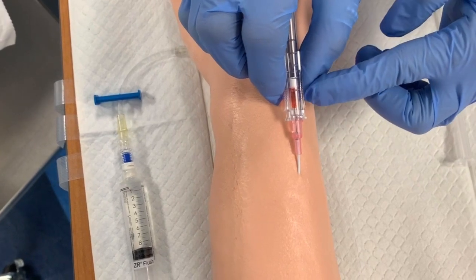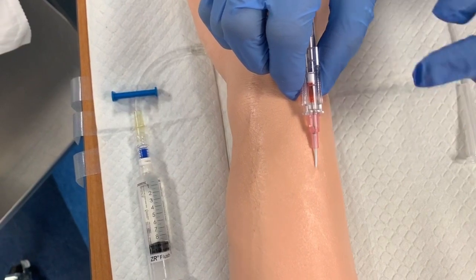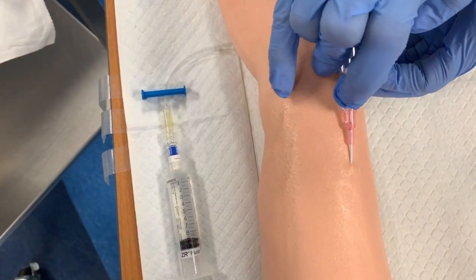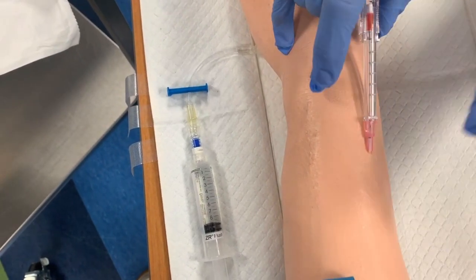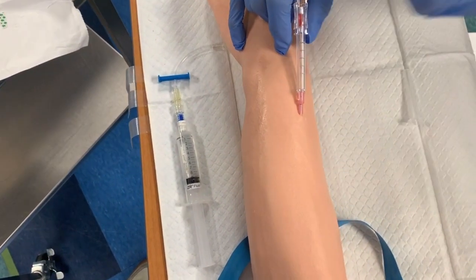Once you get blood return, you'll see it back in your catheter here. And once I get that initial blood return, I advance my catheter just a squitch more, a couple millimeters, and then we can activate our safety device. So we're pushing the catheter in and pulling back the needle. Did you hear that click? That's our needle disengaging. Now we're going to remove our tourniquet, otherwise we're going to have a bloodbath.